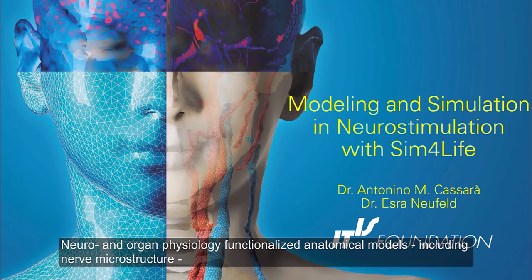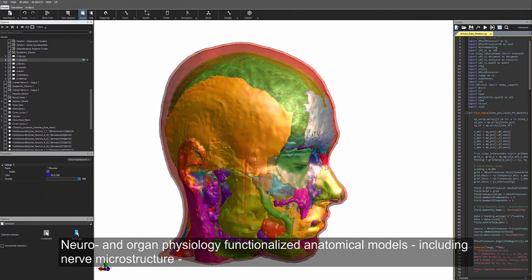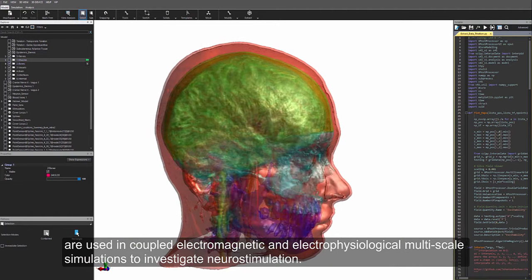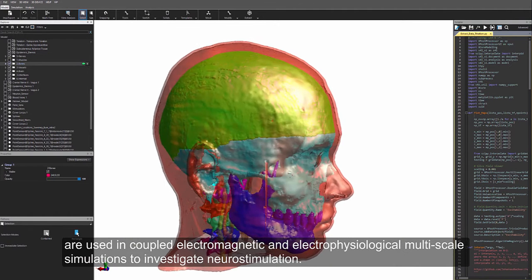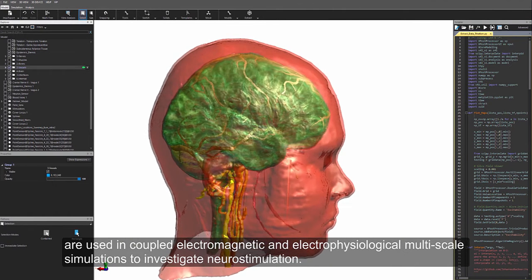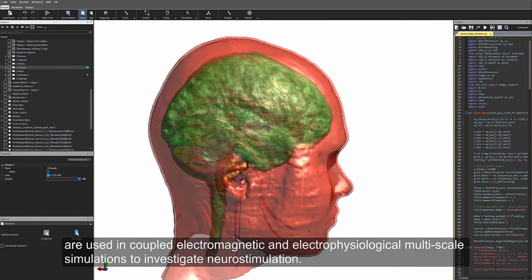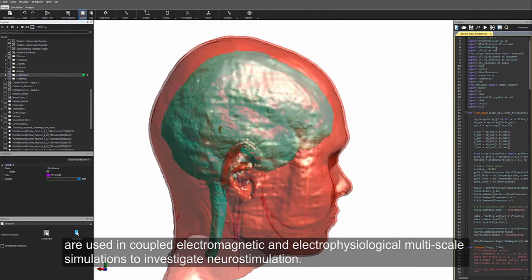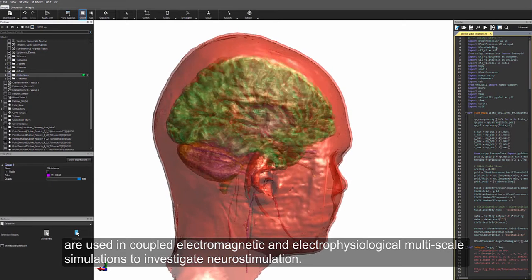Neuro and organ physiology functionalized anatomical models, including nerve microstructure, are used in coupled electromagnetic and electrophysiological multiscale simulations to investigate neurostimulation.